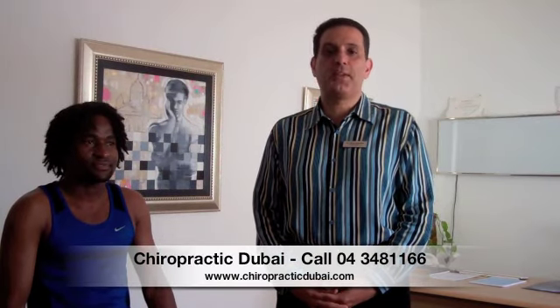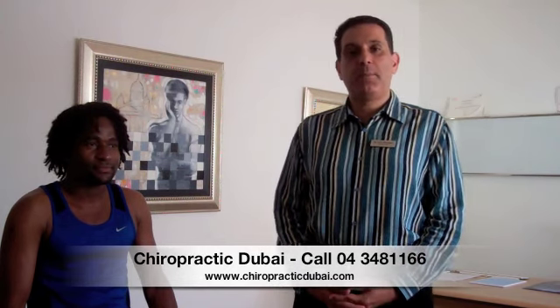This is Dr. Jerry speaking from Chiropractic Dubai at the Emirates European Medical Center in Dubai, UAE. We're going to be demonstrating today a procedure known as kinesio taping. This kinesio tape was developed back in the late 70s, early 80s.